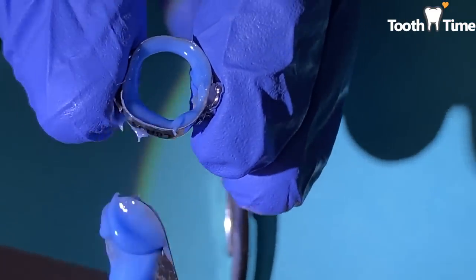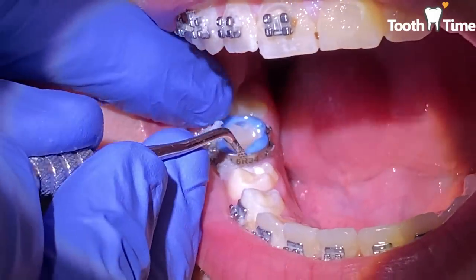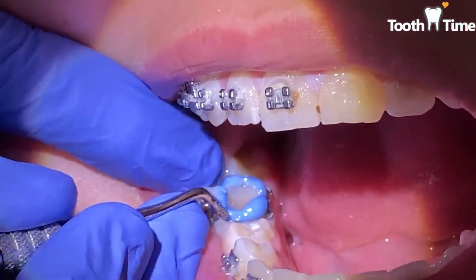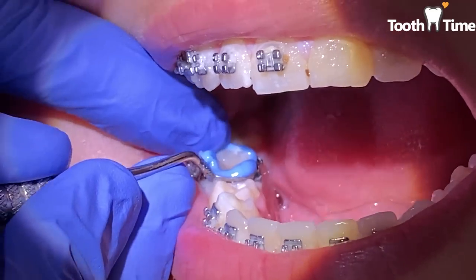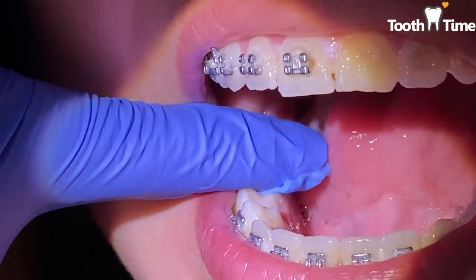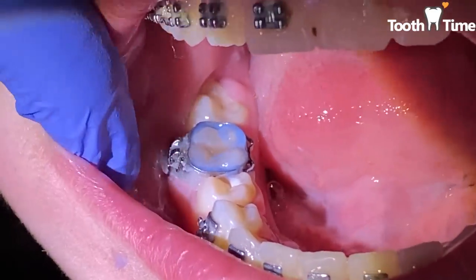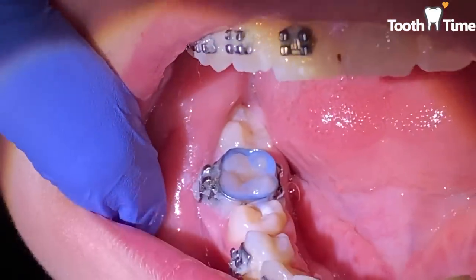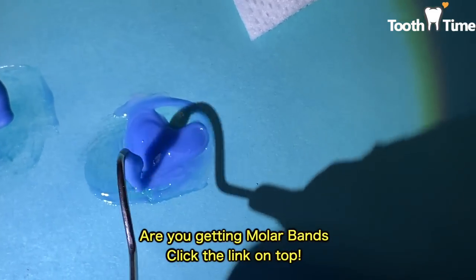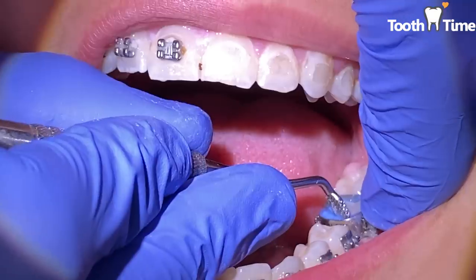Now we're going to remove the lower lingual appliance and just place some molar bands, because it is no longer needed. If you're curious as to why we didn't place spacers, it's because the teeth already had space from the molar appliance we had on the bottom. We have another video on placing molar bands linked above. We're going to place new molar bands on the bottom and use our Fuji glue.